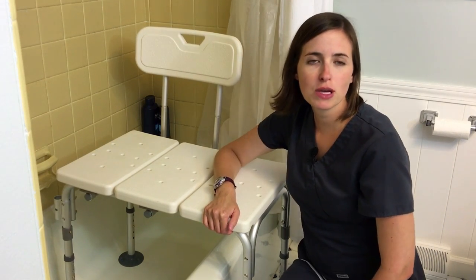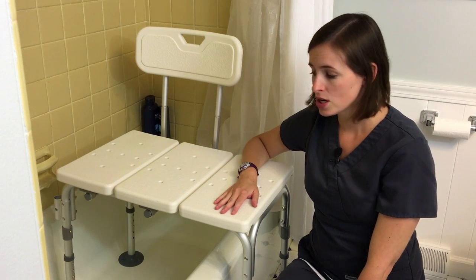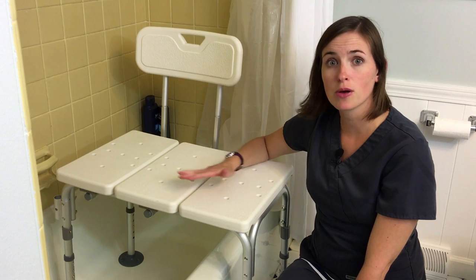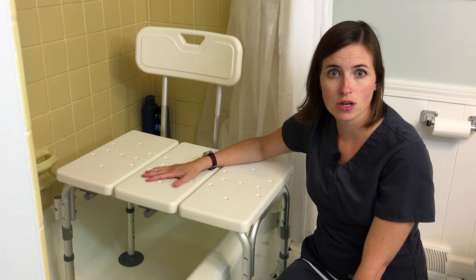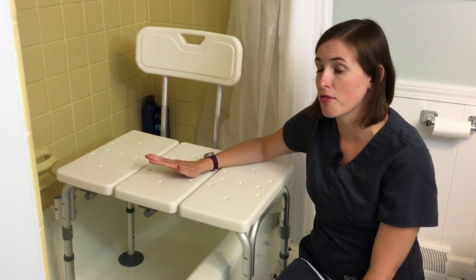Hello, this is Lindsey from EquipMeOT, here today to talk about installing a tub transfer bench. I have a standard plastic hard body tub transfer bench that has been pre-assembled. If you have any questions or concerns about how to assemble a tub transfer bench, please check out our other YouTube video which will go into great detail about that.